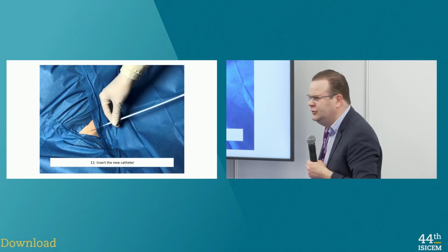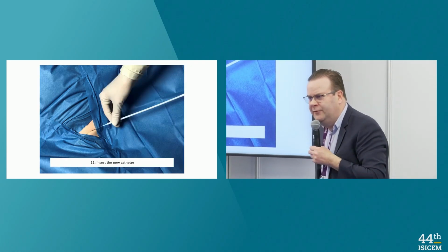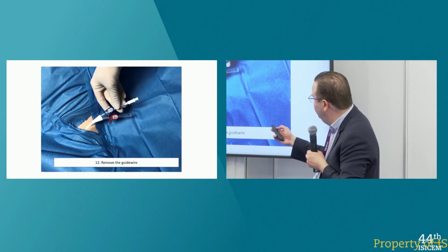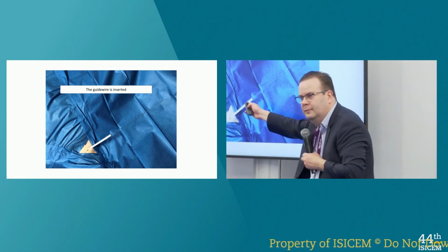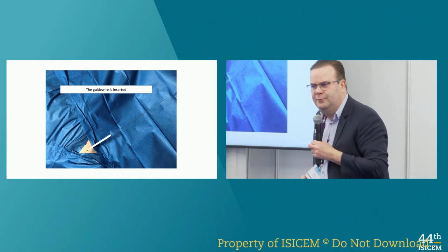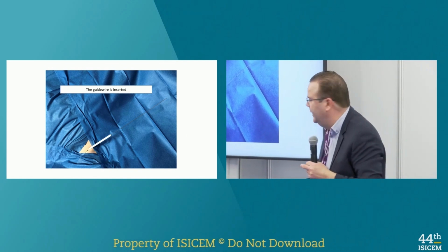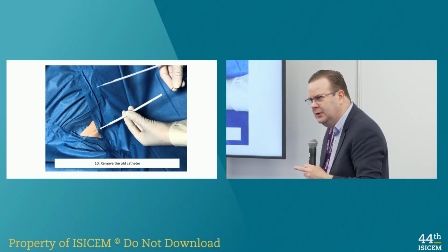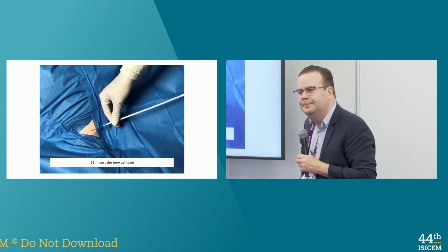Okay, so you have to pay attention to put your patient in a good position to avoid pulmonary embolism here. Because at that moment, theoretically, there is a risk of pulmonary embolism, but if you place the head below, then it's okay. So you have to pay attention to this risk and to do it in the right position. But then if you do it in the right position, it's very clean to do it in this way.